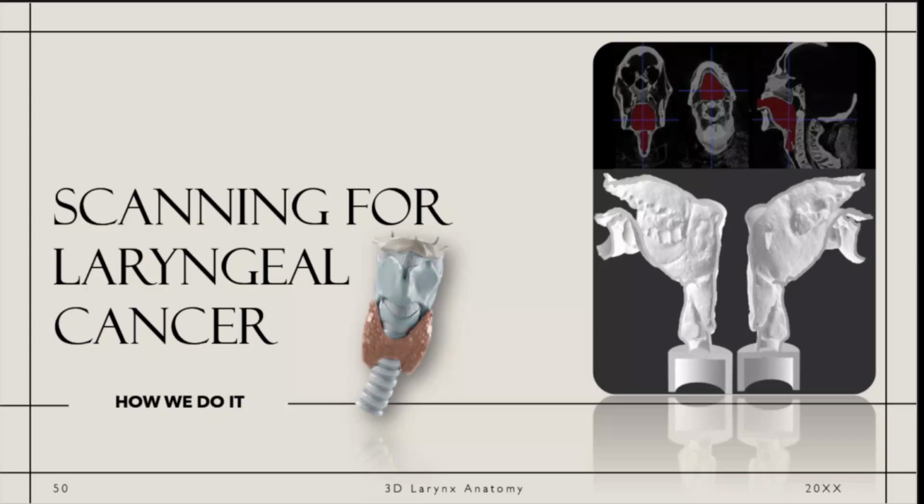Okay, so how are we scanning for laryngeal cancer? What do we do as radiologists? How do we see if there is an abnormality?